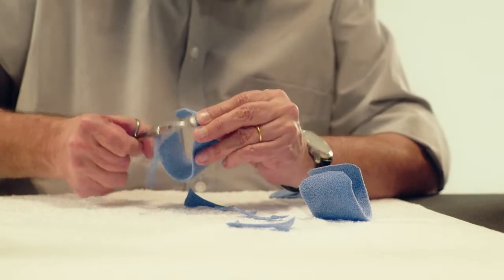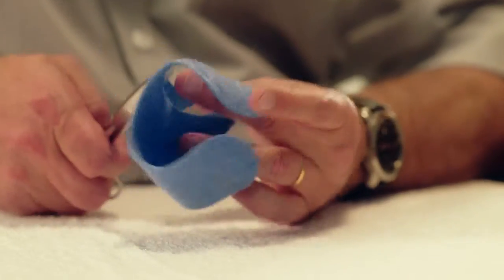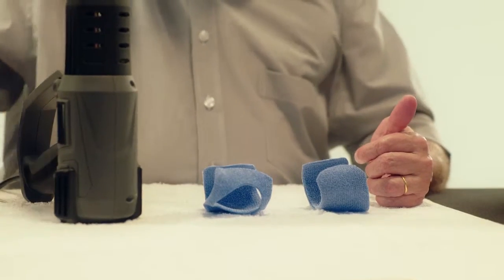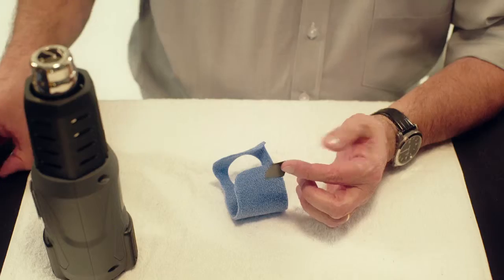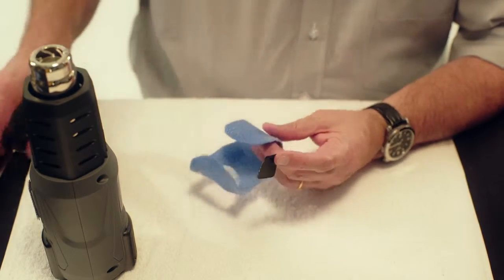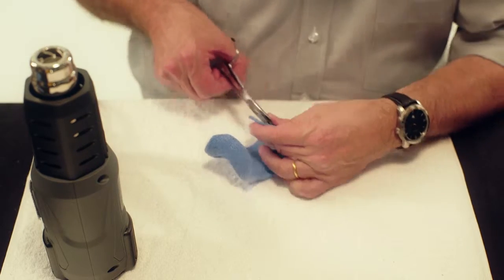Enlarge the hole for the thumb as much as possible. Take a piece of self-adhesive Velcro hook. Heat one side of the forearm-based portion with a heat gun. Briefly heat the self-adhesive glue and stick together.